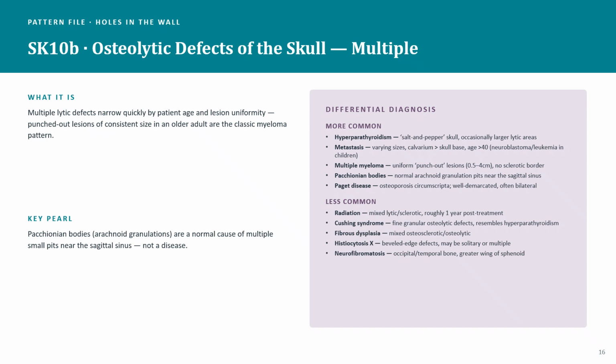All right, so again with these lesions, we're typically going to be looking at age. This typically is going to be seen in our older patients. And with this also, the doctor might start to lean toward multiple myeloma.